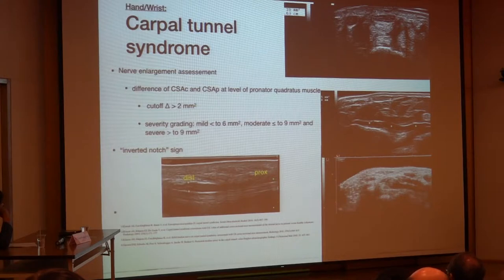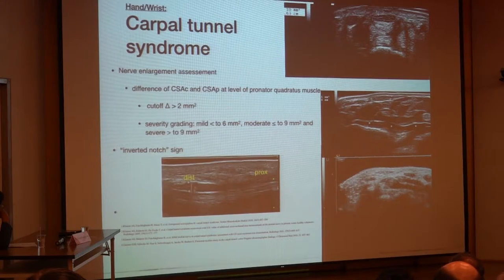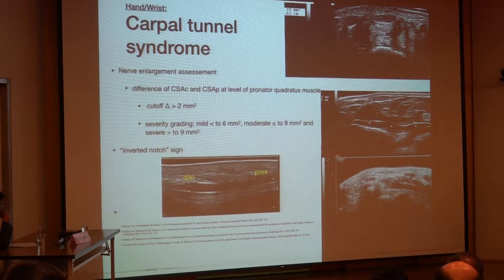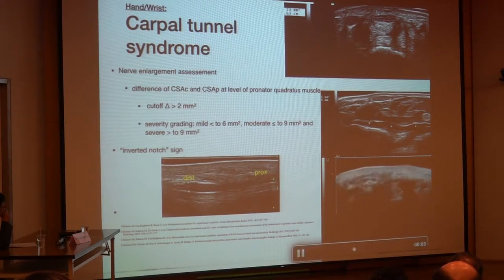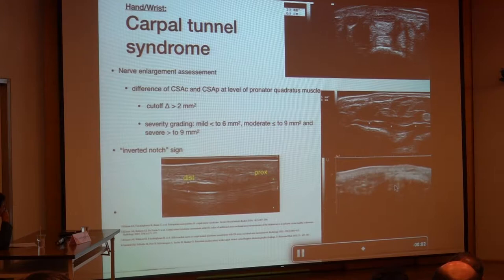There are some hints we have to think about, like the inverted notch sign. This is the median nerve in its long course at the proximal level of the carpal tunnel. It might happen that the swelling is located at a very distal level, so we have to scan the carpal tunnel across all its different parts. Here is the median nerve and the retinaculum flexorum, and coming with the probe more distally, we can see a distal enlargement of the median nerve, which should be used to obtain the measurements.